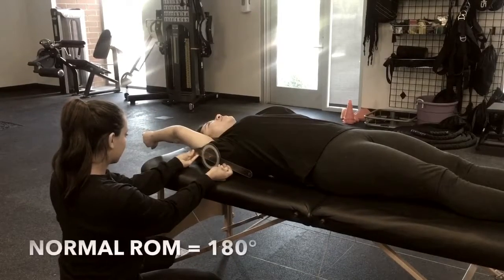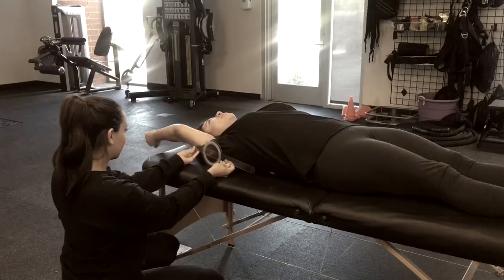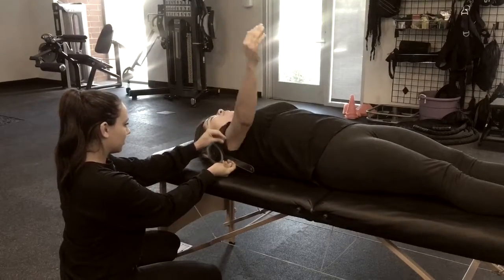The normal range of motion for shoulder flexion is 180 degrees. Specifically shown in this video, this client received 180 degrees shoulder flexion.